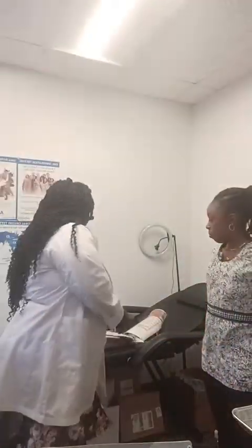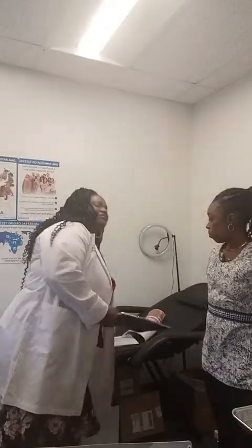What I'll do as the collector, I'm going to go ahead and put the information in step 2 of my CCF form. What is the form of specimen? I'm going to go ahead and check urine. It's a split collection, and it's within the range, and boom, no remarks, because there is nothing to remark about. Everything went well. Remember, this is uneventful.